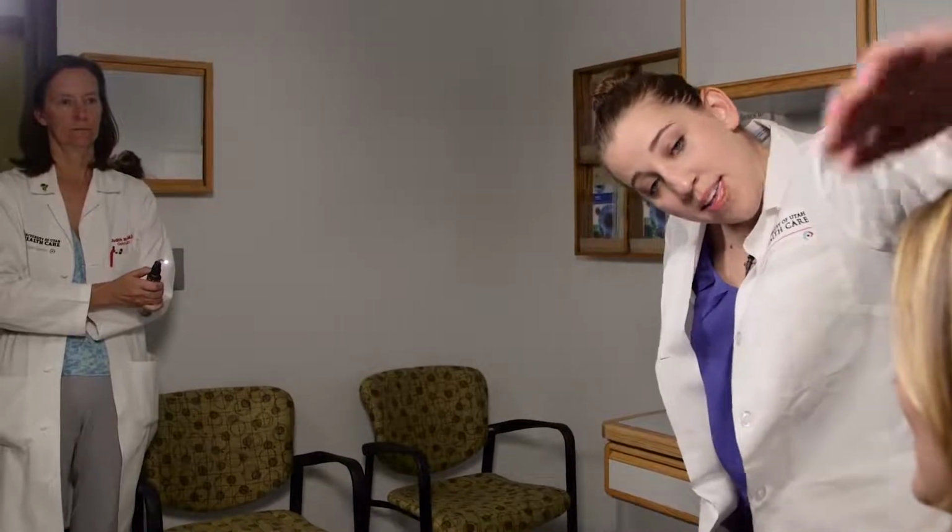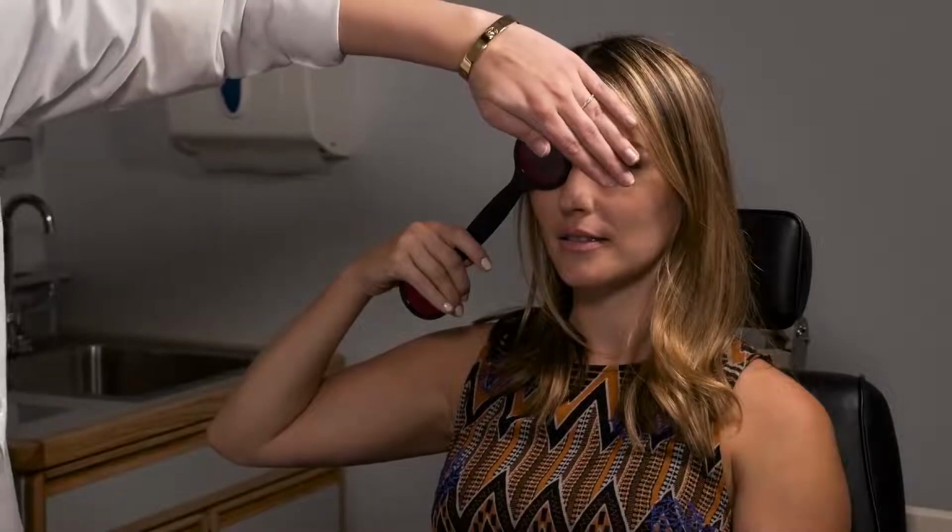So can you appreciate that there's a horizontal red line when you're looking through your right eye? Yes. Yep, and you can kind of rotate that to make it perfectly parallel with the floor. Okay, so when you're looking down at that light, the white light, sorry, is the white light above or below the red line? Or right on? Right on it. So she's very well aligned. So the light and the line are at the same level.